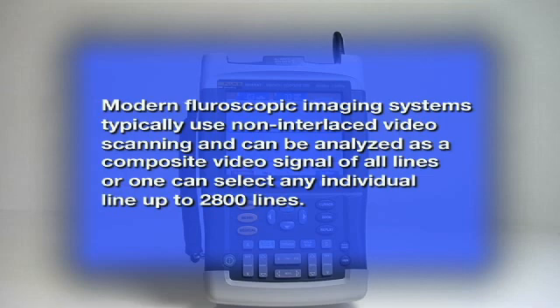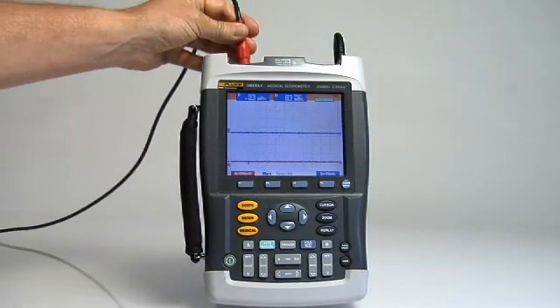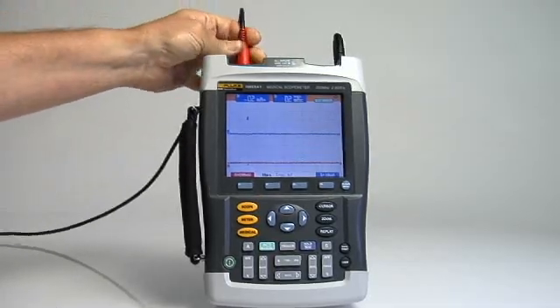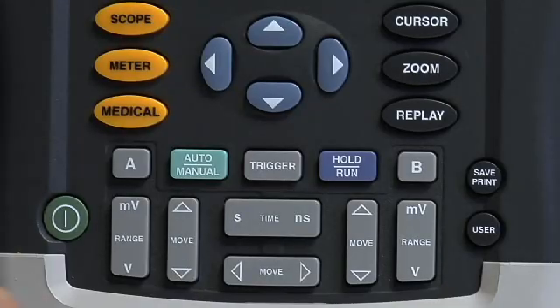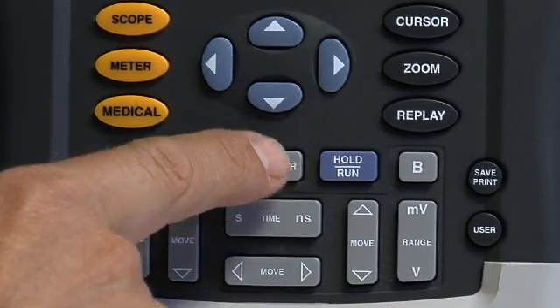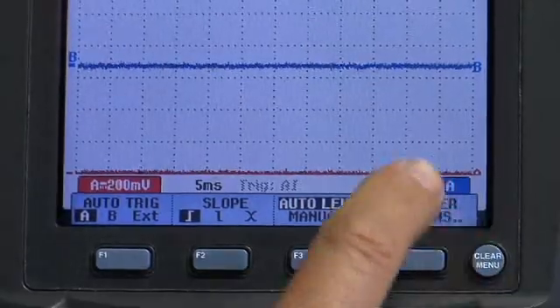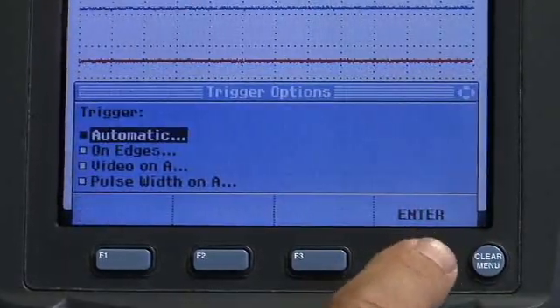Start by applying a video signal to input A. While in scope mode, depress the gray trigger button, next select trigger options on the menu bar and toggle to video on A.